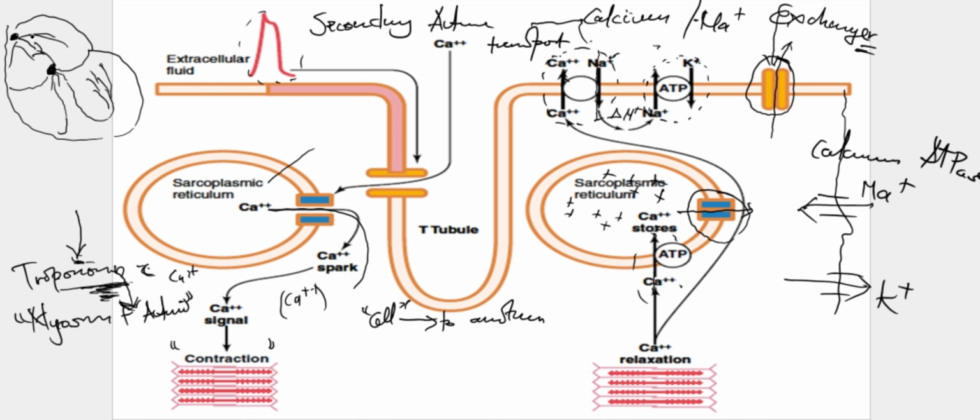So when you are mapping the movement of this action potential from one spot into another, this is what can be represented in our ECG by what we'll be able to see: the P wave, the Q, R, S, and then the T wave. So this becomes the ECG.